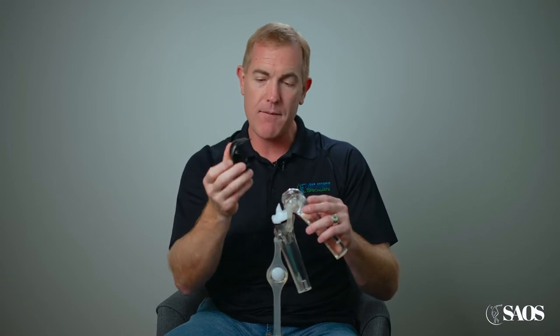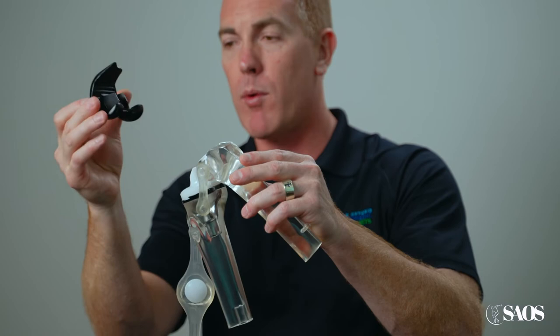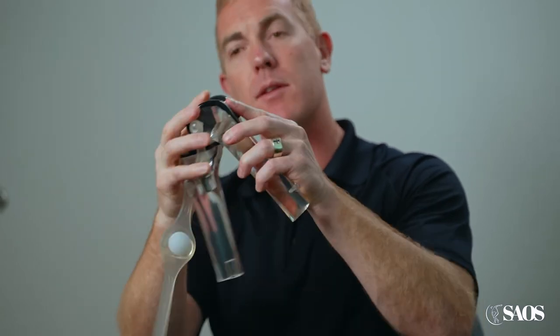The knee that I like from Smith & Nephew is designed to more naturally match your normal anatomy. When we do the knee replacements, we trim up the diseased cartilage, but we have an implant that basically just caps the end of the bone — so we really just resurface it.